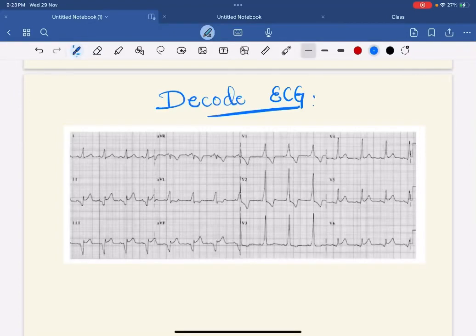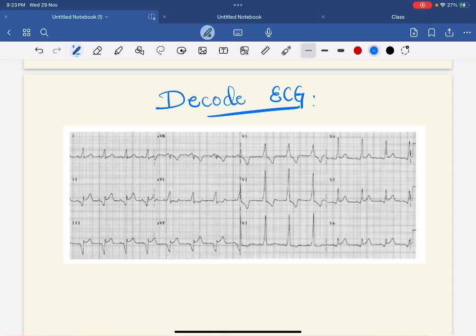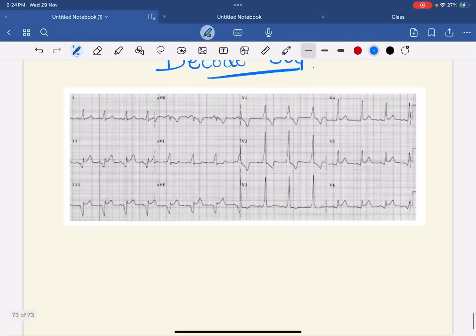Hello friends, welcome to another episode of decode ECG series. Here we have an ECG which is very interesting. Assuming that it is taken with normal standardization.